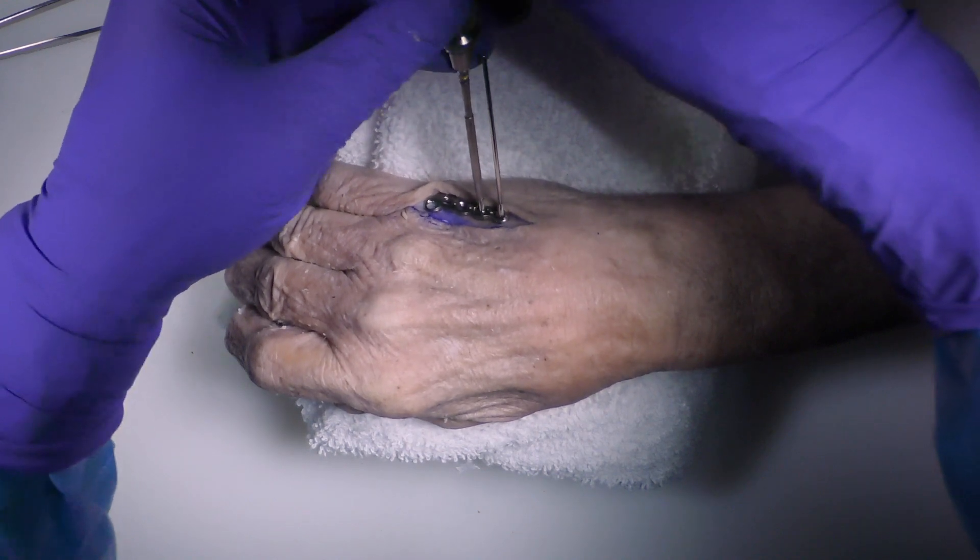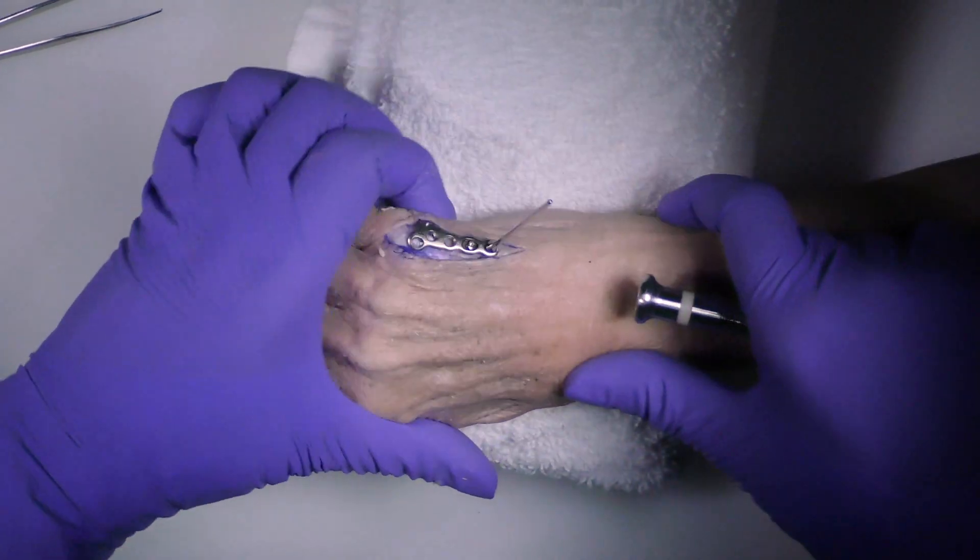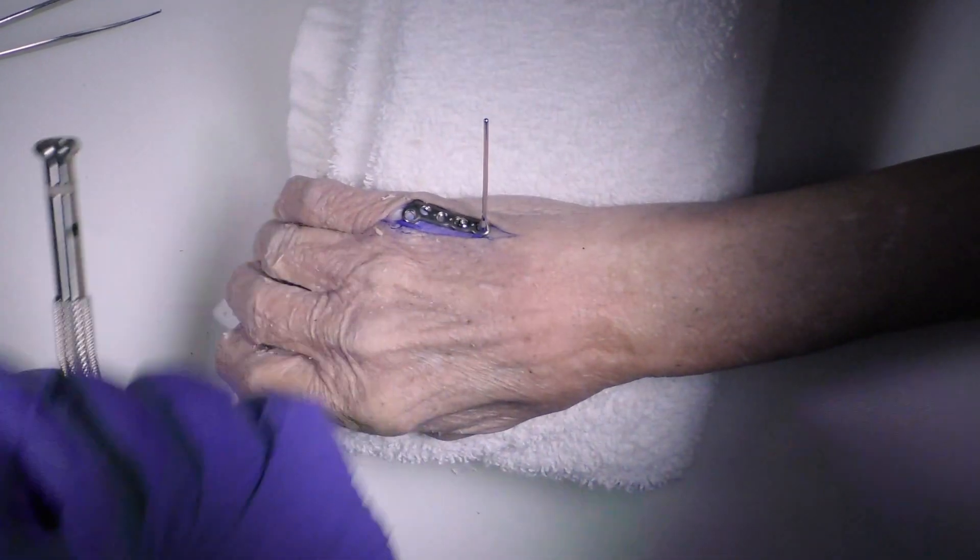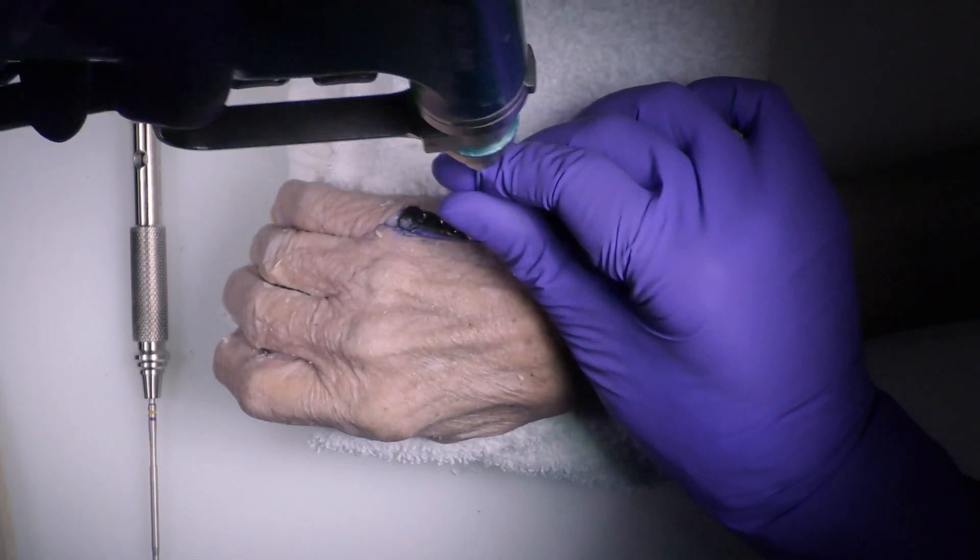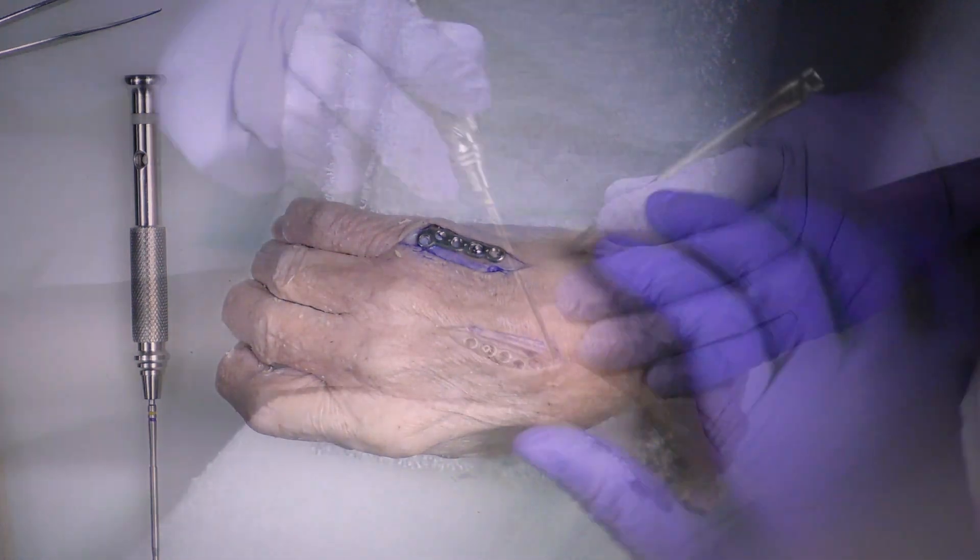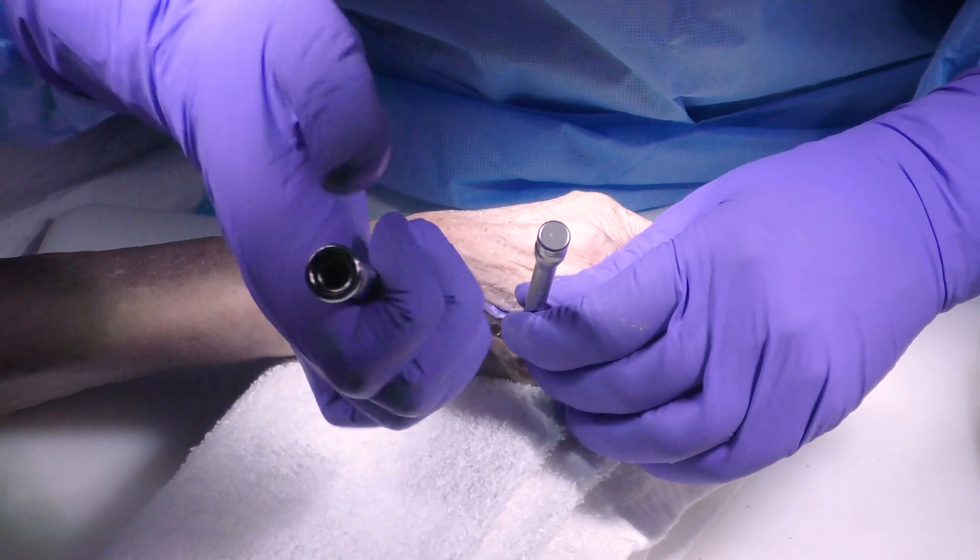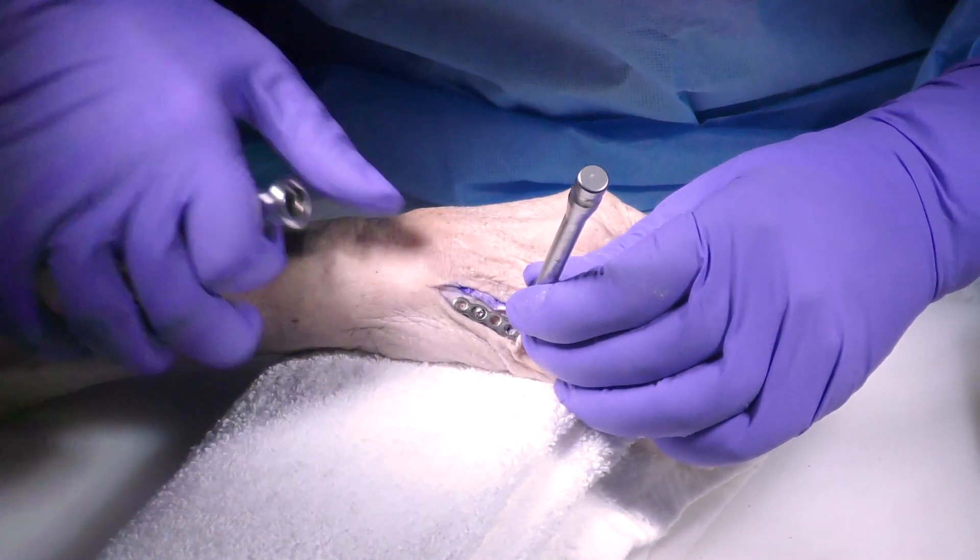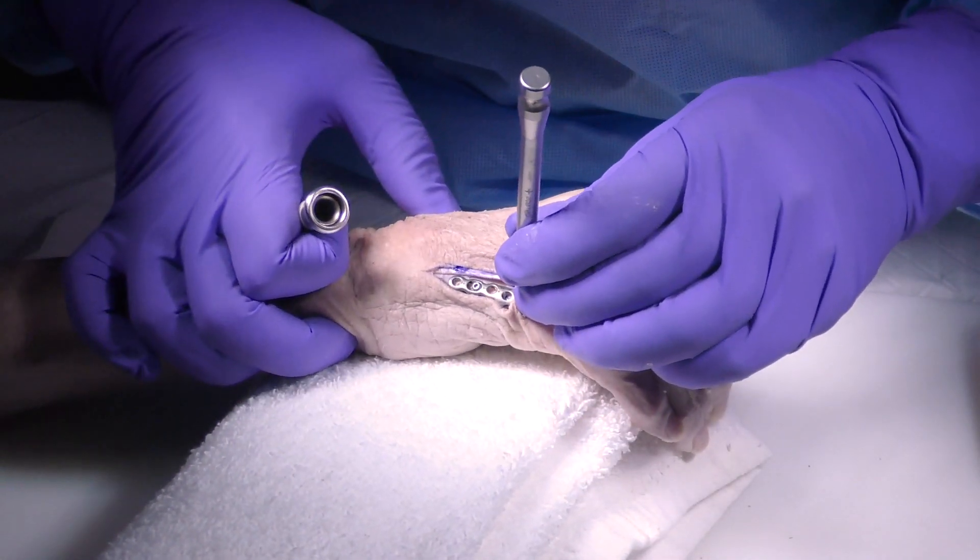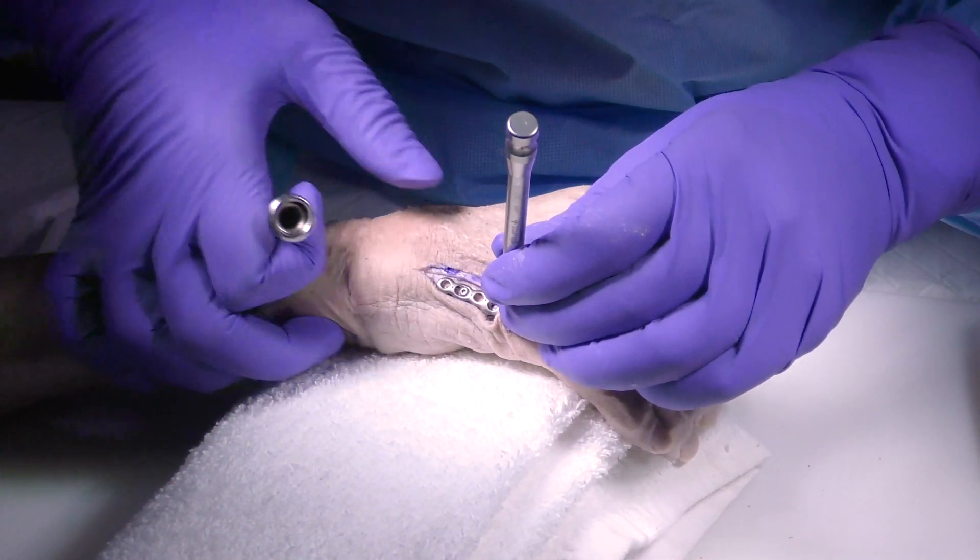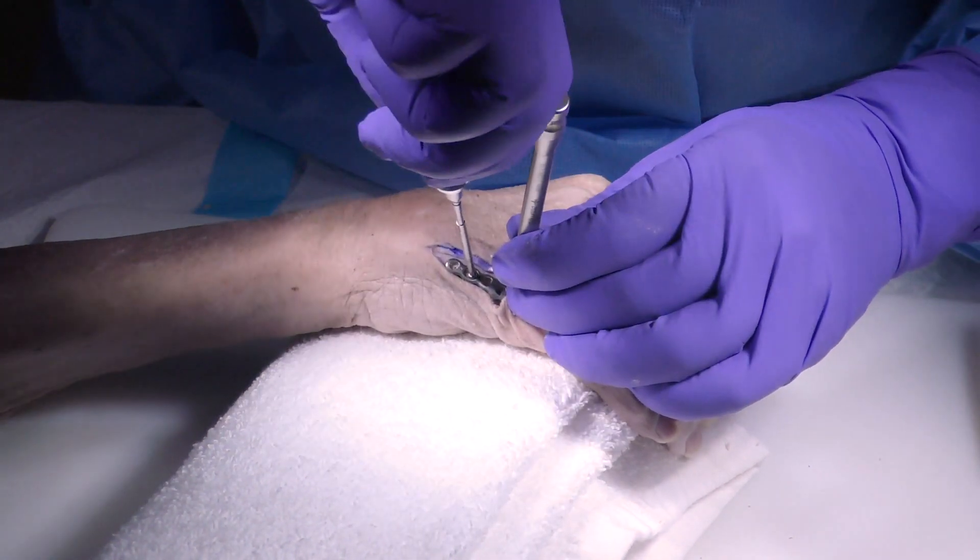I'll take the wire driver back next, please. I'm not going to quite put it all the way down. Like I said, I'm going to slide this plate back a little bit. What I'm doing right now is sliding it back. You'll appreciate how it's further back in the hole, hopefully. I move back about two millimeters, like so. And so now I will tighten it down.